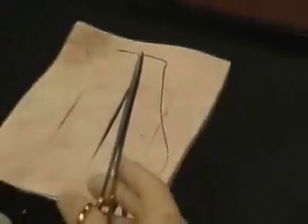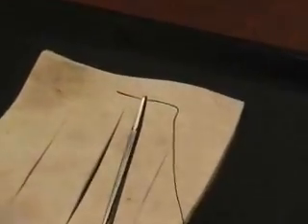And we're loaded up at about the distance between the, if you think about this needle being in thirds, if you were to divide it in thirds, this is the proximal third, and then the middle third, and the distal third. We're at the junction between the proximal third and the middle third. Of course, we're going to choke up toward the point if we're taking a smaller bite, or we'll go more toward the swedge, here's the swedge end, if we are taking a larger bite, but in general, about at this junction is a good starting place. Okay, so we've got the concavity furthest from us, and if you just memorize this position, this is a good starting position.